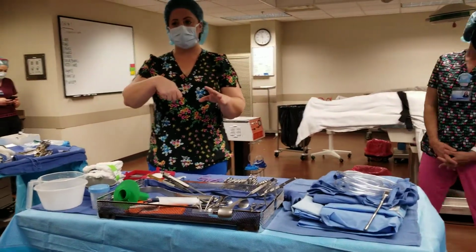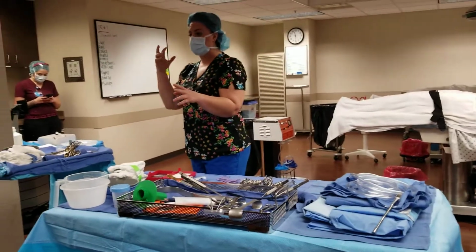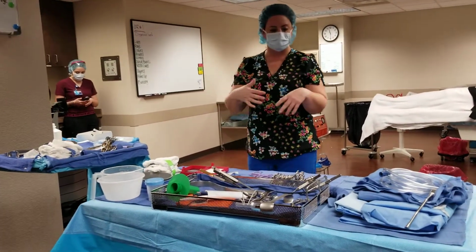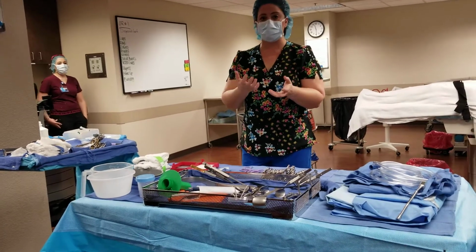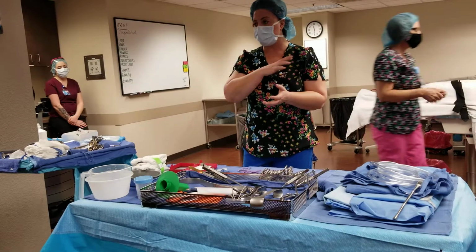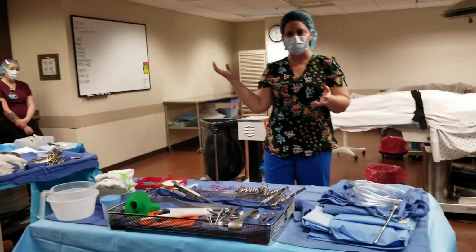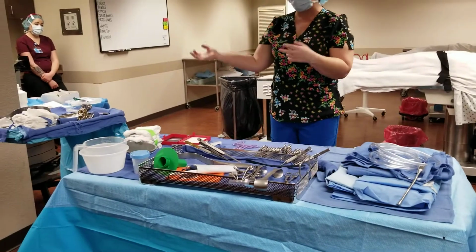Then they're going to puncture the amniotic sac, and fluid is going to go everywhere. So make sure you have your laps ready and suction ready in the real world, and then it's time for baby to come out. At that point, you want to get all metal off your field because you don't want baby to get a clamp on its head or something.